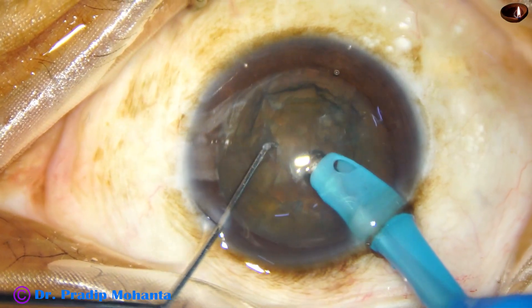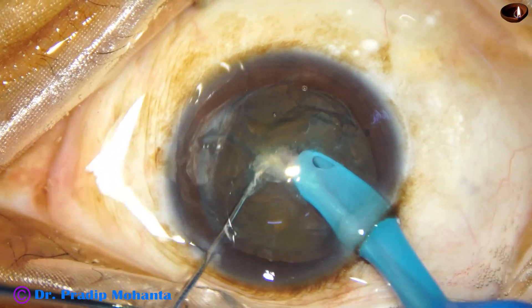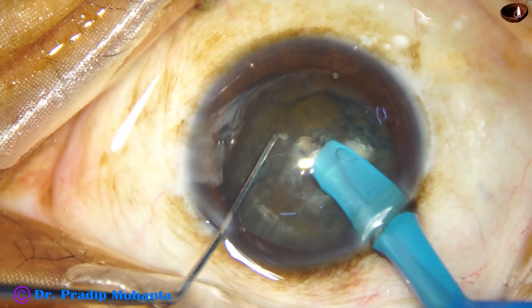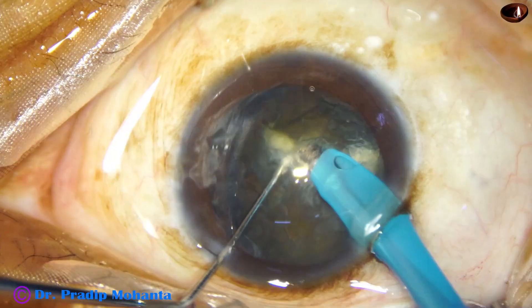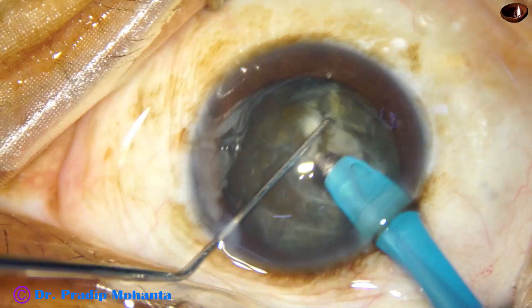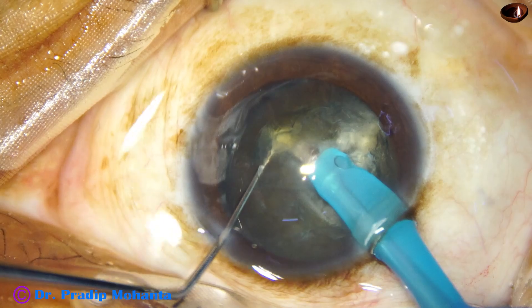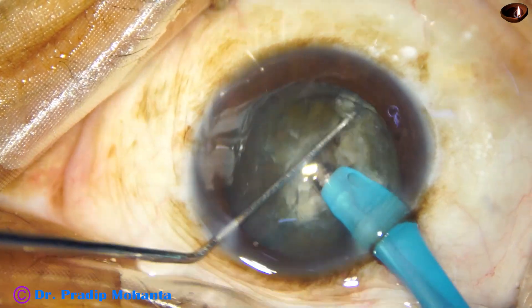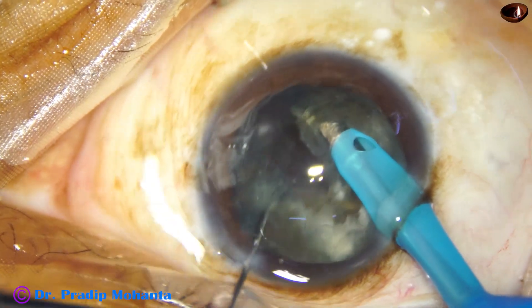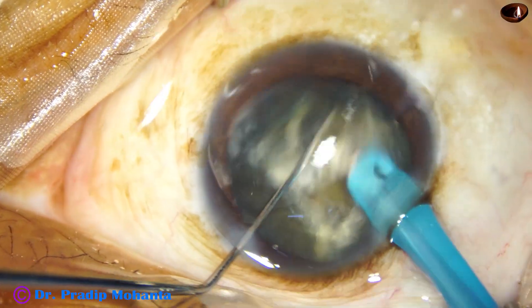The superficial lens matter is eaten off. Now the tip is buried in the substance of the nucleus and I try to get a crack, but the nuclear mass resists cracking. You see, it's resisting the crack. I have to go to a deeper level. I've gone to a deeper level and trying the crack — and I have got a better crack. Every time I'm trying to go to a little deeper plane so that I get a through-and-through crack.